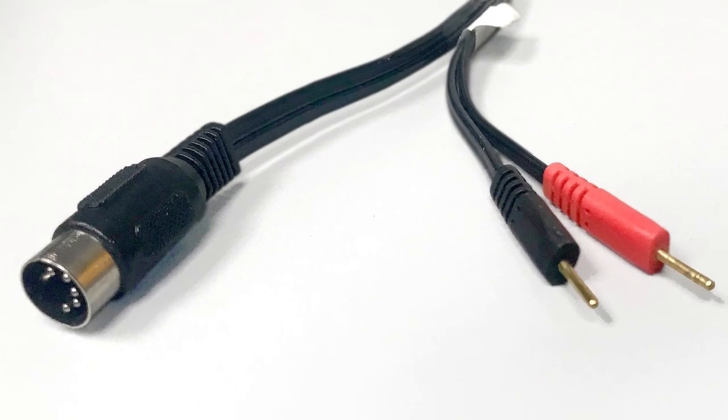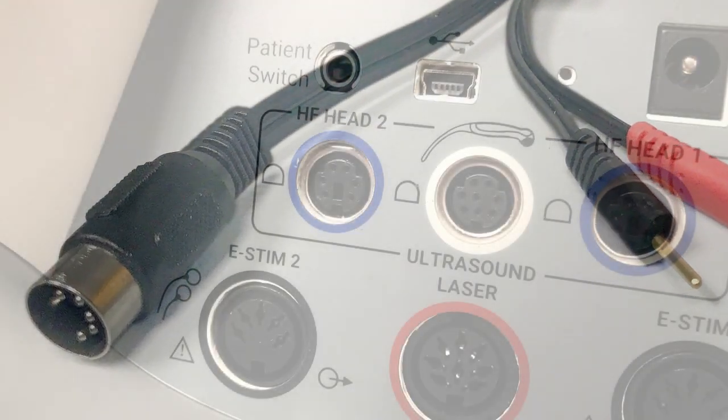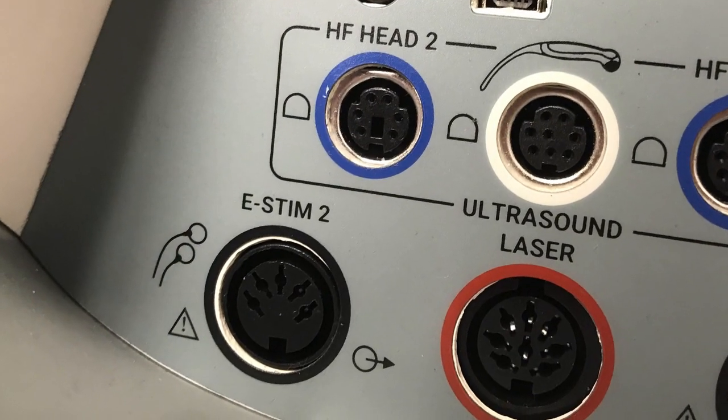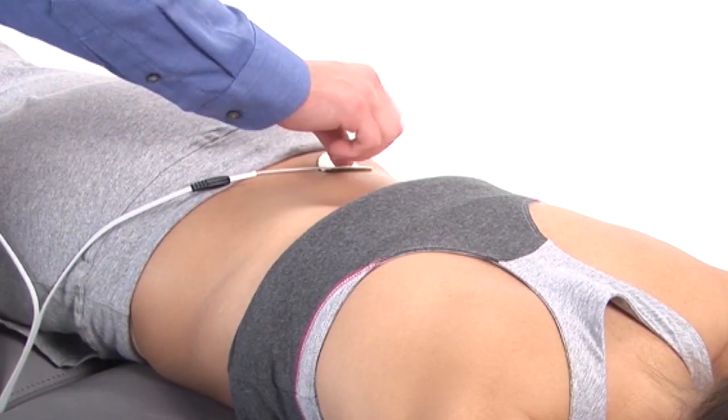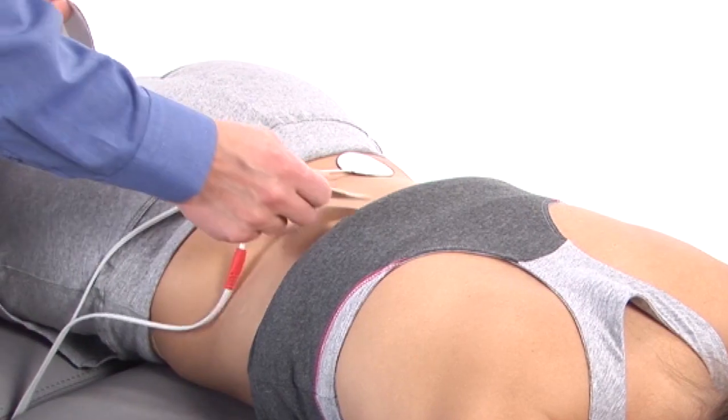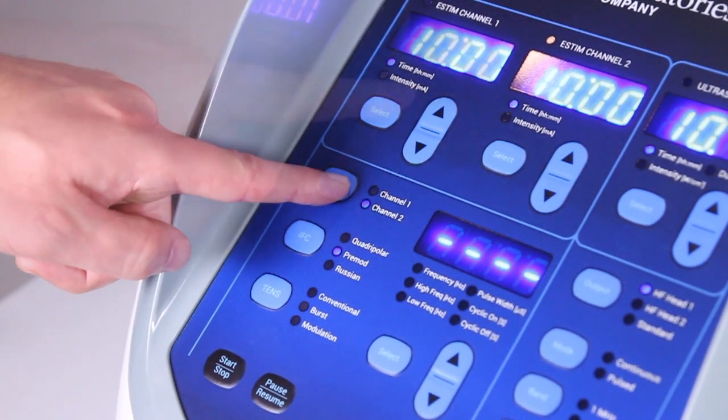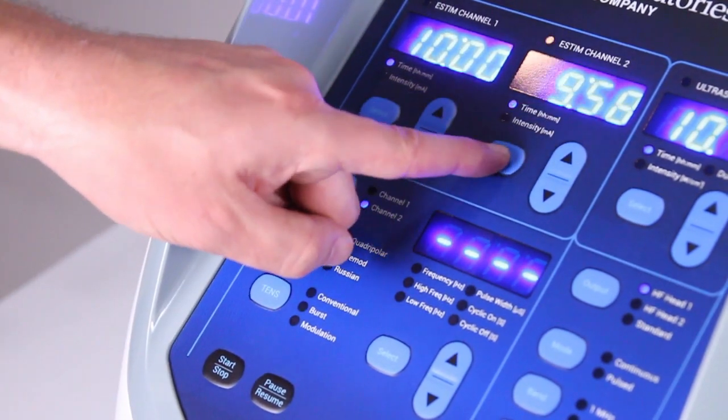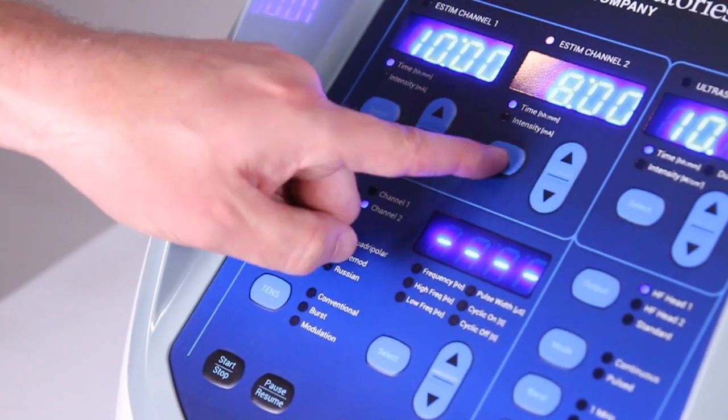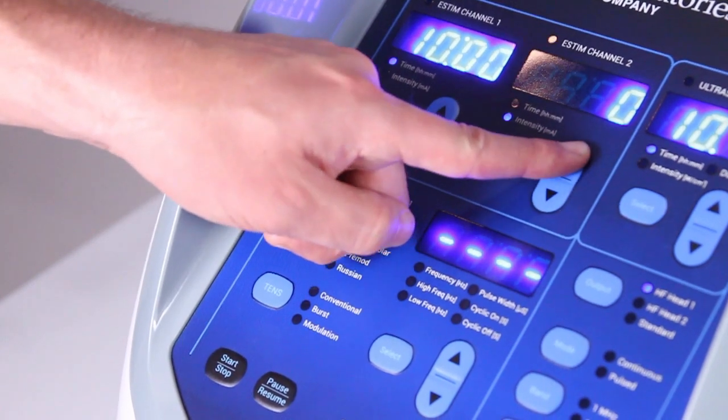A second channel of pre mod can also be added simultaneously with the first. Plug the second muscle stimulation wire into e-stim two and position the second set of pads on your patient. Now select channel two, press start, and enter your time and intensity settings. Settings for channel one and channel two can be completely different from one another.